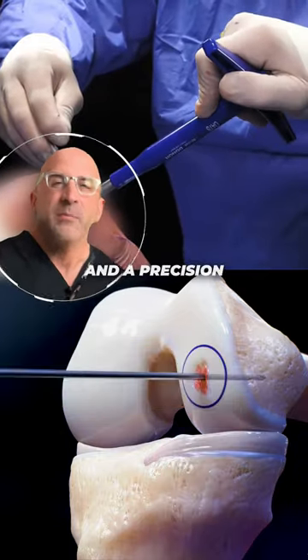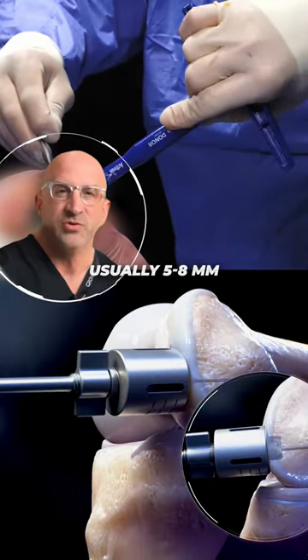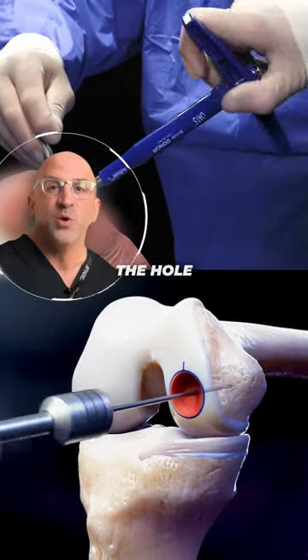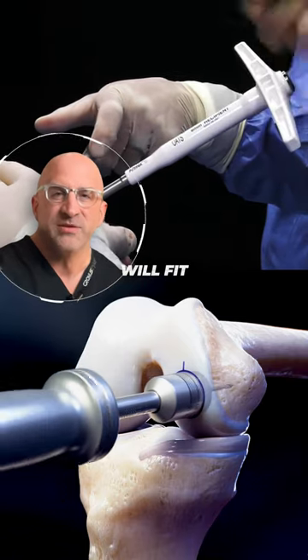Your surgeon marks the spot and a precision drill is used to create a snug socket for the new graft, usually five to eight millimeters deep. A dilator is used to widen the hole about 0.5 millimeters to ensure the graft will fit perfectly.